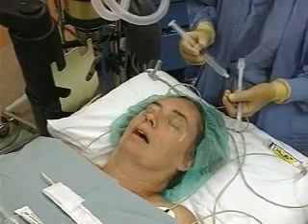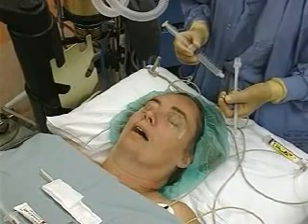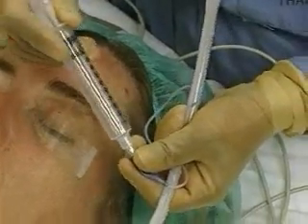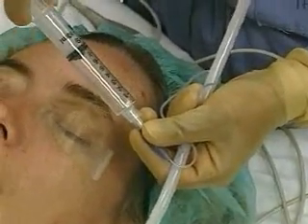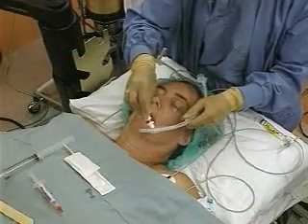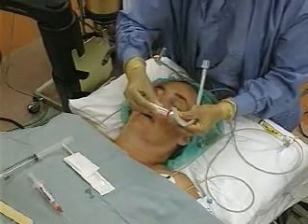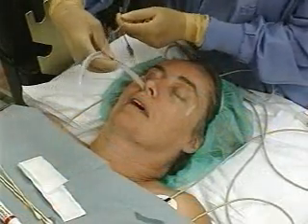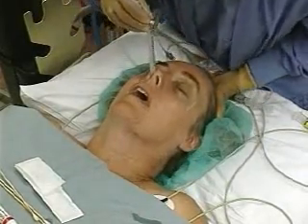Nasal intubation is generally done in the awake, spontaneously breathing patient when there is an advantage to avoiding laryngoscopy, such as with a cervical neck fracture. Check the endotracheal tube cuff for leaks by inflating and deflating the balloon with 10 milliliters of air. Coat the end and cuff of the unstyletted tube with viscous lidocaine jelly; if warm saline is available, the tube may first be soaked for three minutes. Place the tube gently in the nose and advance it using the technique described for the nasal airway, and gently extend the neck if the tube is difficult to pass.